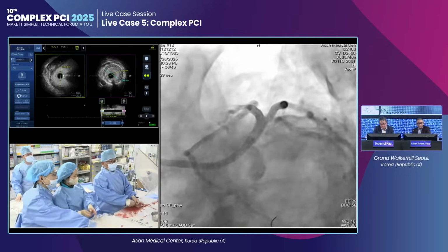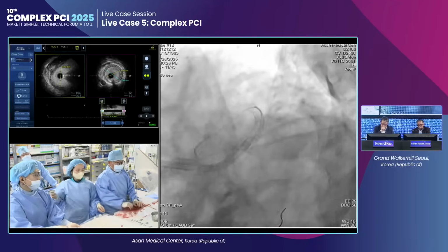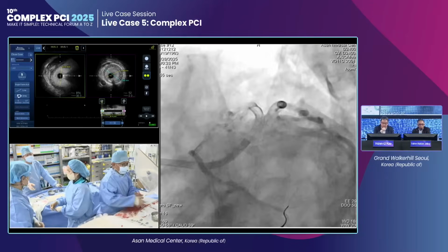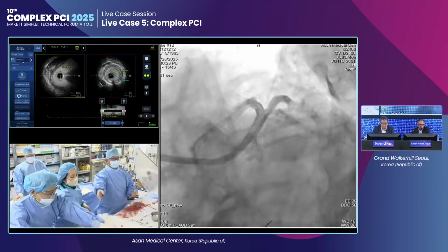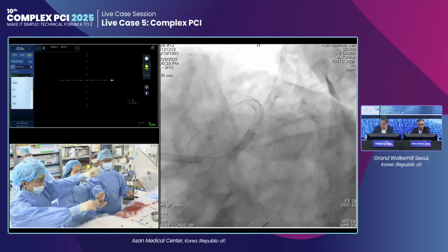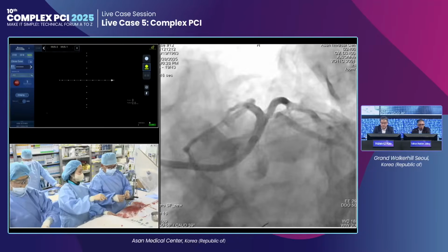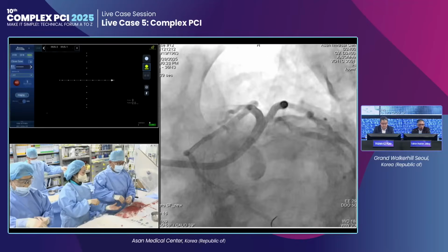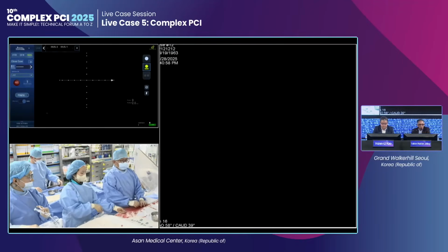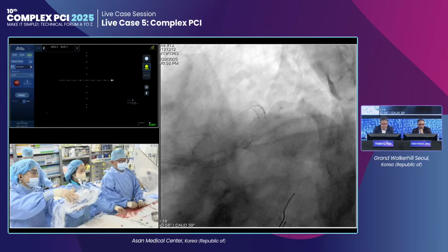Yeah, it's beautiful. We're going to see if we can go across to Dr. S.J. Park's lab and let you work in peace. But I'm going to guess you're going to do a kiss and then IVUS. Yes, actually, I will see the IVUS first. Okay. All right.